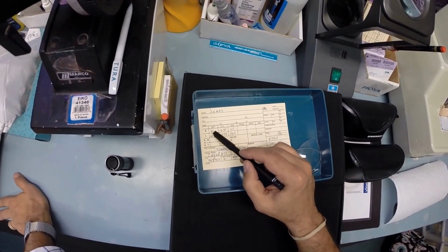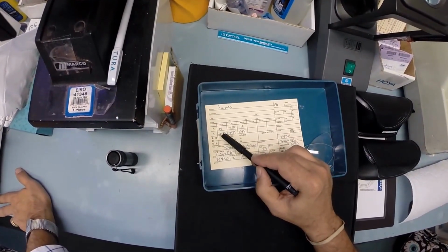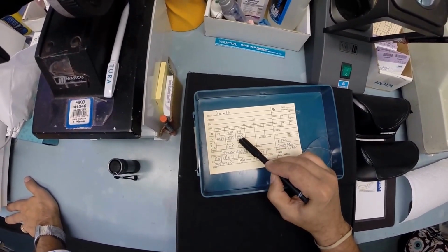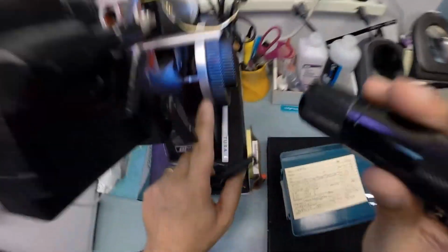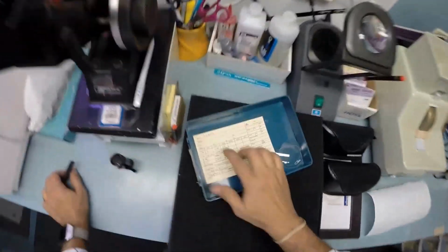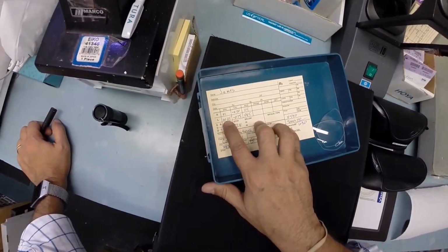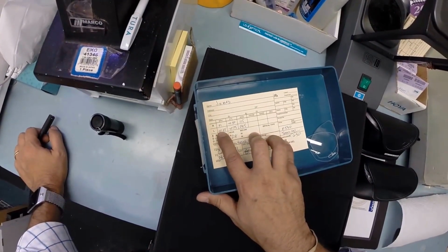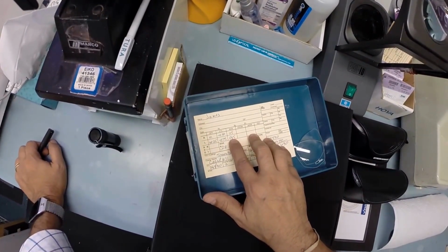This first number gets everything to the correct size. Now you don't need any resizing for your right eye. You need 1 step of correction for your left, but you have 3 steps. You have 0.75 astigmatism on your left, and we turn that axis knob to a 95. So let's check your astigmatism on the right eye. At 2 steps we're at minus 50, exactly halfway between 0 and 1. So your right eye is your better eye. You actually need 4 combined steps of correction for your left. You need 1 step of magnification. You are farsighted, so that's why there's a plus sign. Your lens will magnify to the correct size. Then you have 3 steps of astigmatism correction. And the curvature is at the 95th meridian.